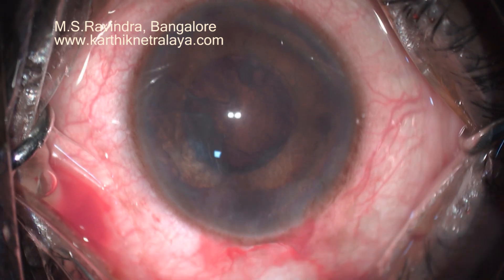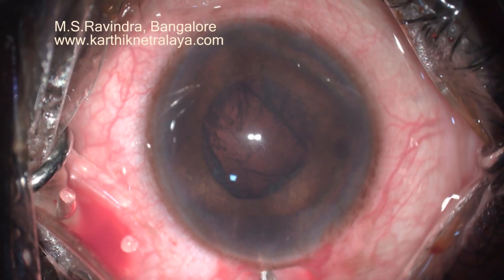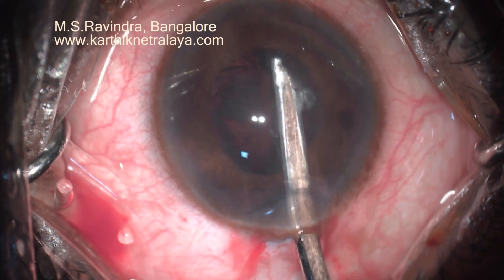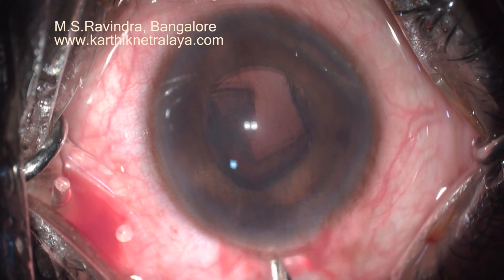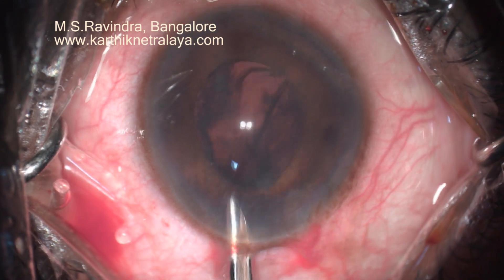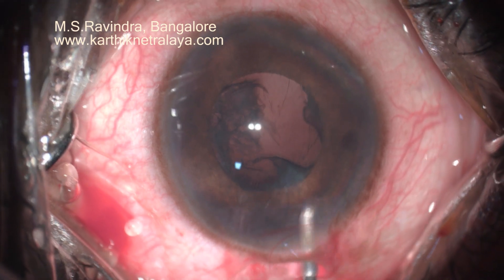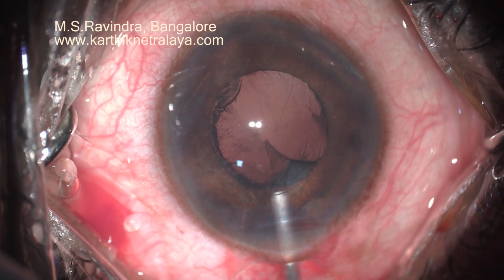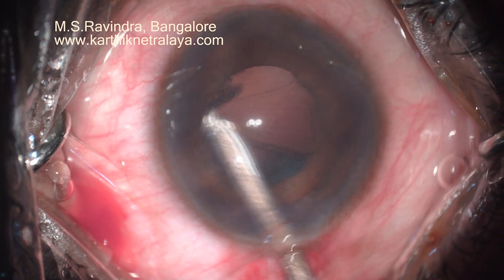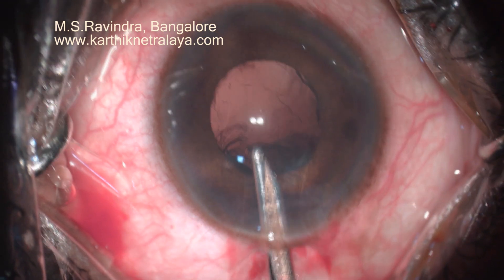Cortical aspiration is done. Initially, the cortex in the anterior chamber is evacuated to protect the endothelium. The infusion is controlled by a silicon bulb. The amount of fluid that goes inside the eye is very minutely controlled by my right hand, and aspiration is done with my left hand, so very intricate irrigation-aspiration can be done to maintain the chamber depth and to avoid loss of chamber.